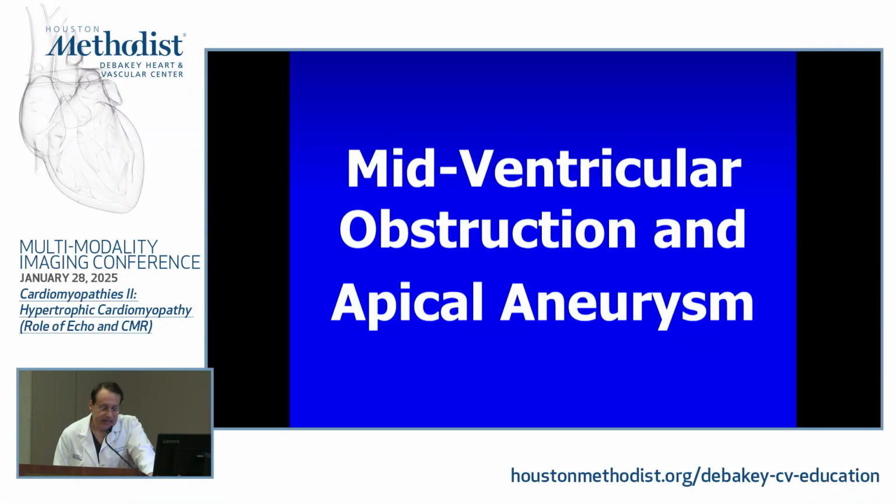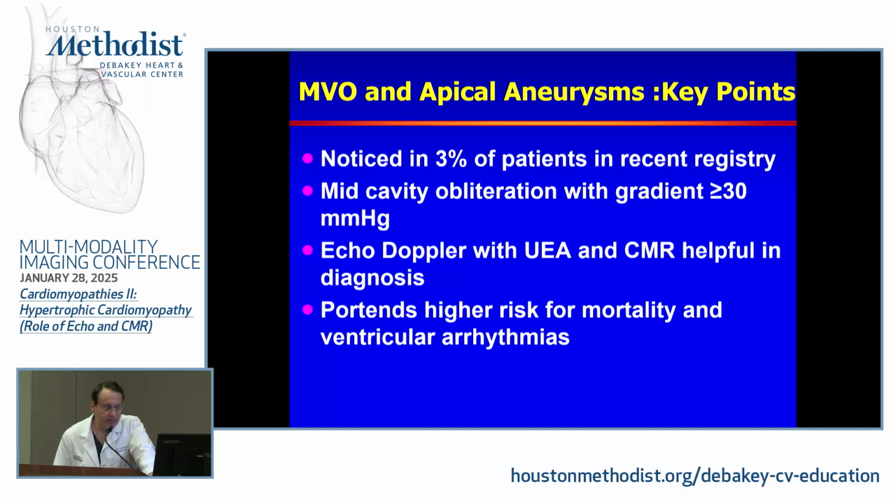Mid-ventricular obstruction is an entity that you will see as you see more and more patients. It was noticed in about 3% of the patients in a recent registry, a multi-center registry.